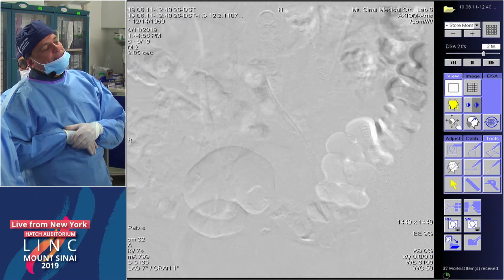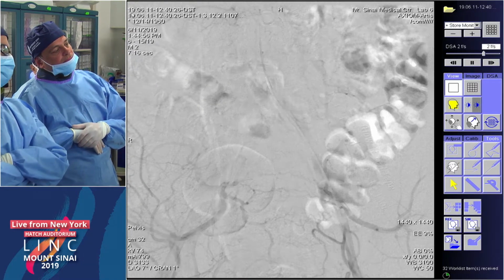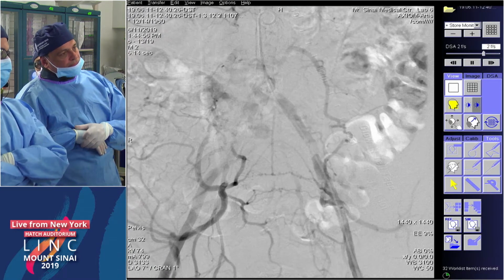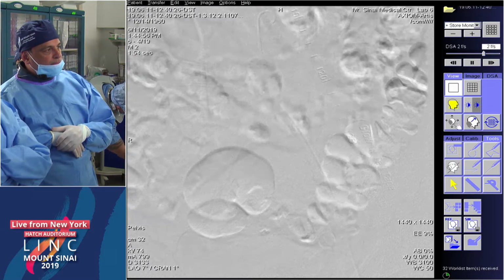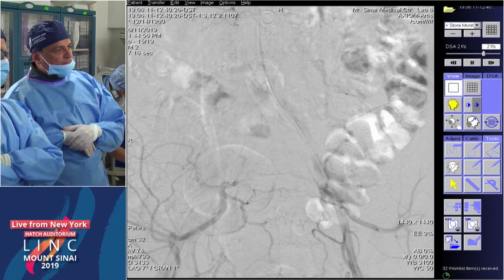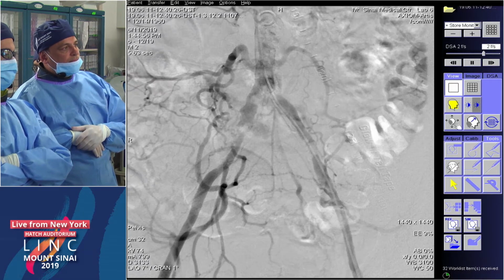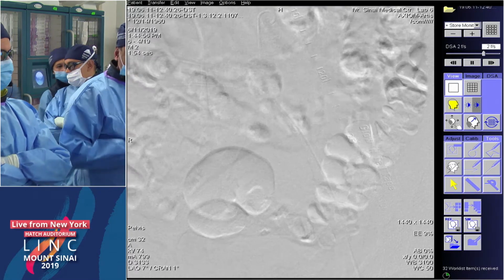Okay, so both of your lesions are really common iliac lesions. And if he's got bilateral hip and buttocks claudication, I would probably fix both with kissing balloons. I like the VBX here because you've got some angulation there. And so I would pretty much do what Andre just taught us to do of going in and putting bilateral stents up and then inflating them under observation and do it gradually, knowing that you have a little bit of foreshortening. So I put a little bit further into the aorta with the VBX and then start with like a 7 and go up to an 8, and you can go to a 9, which I doubt you'll need, but I'd go 7, then probably 8.